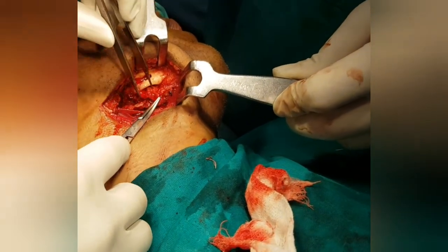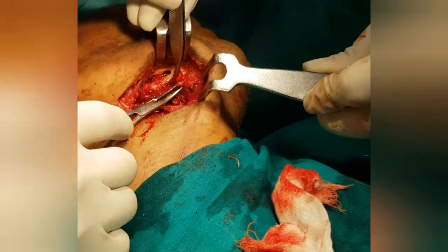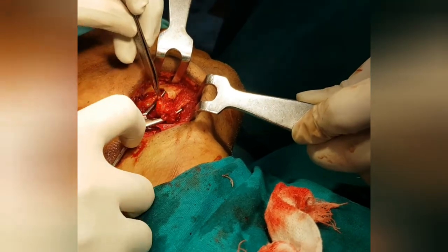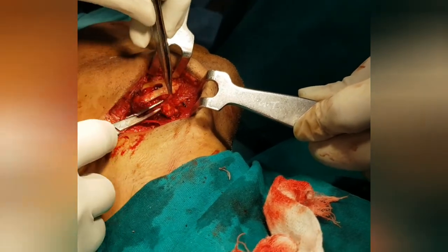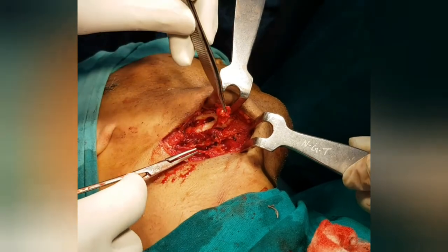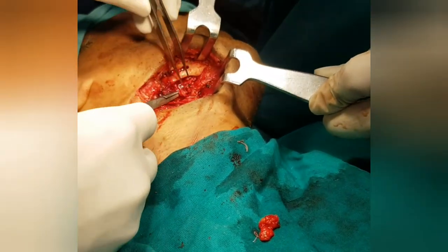I retracted the tumor from the lingual aspect of the mandible. This is the content of the tumor. As my radiologist discussed with me, the tumor on CT scan appeared completely solid, like fatty tissue, and surgically I can also see the fatty content of the tumor. It is not well encapsulated, so we had to be very careful while removing it to ensure all content of the pathology was completely annihilated from the site.